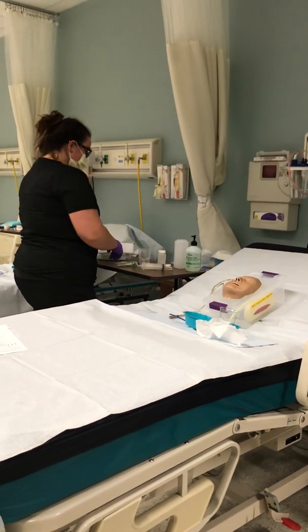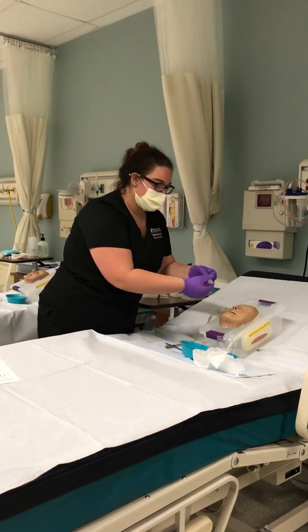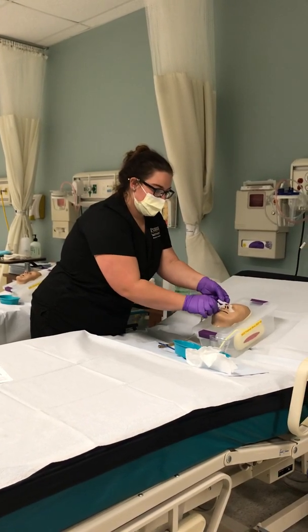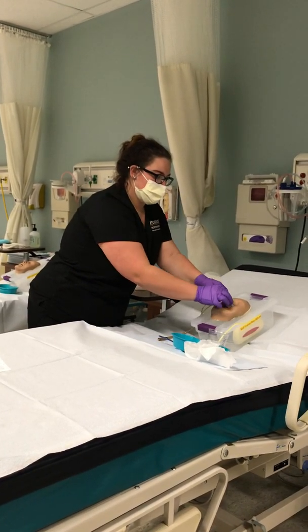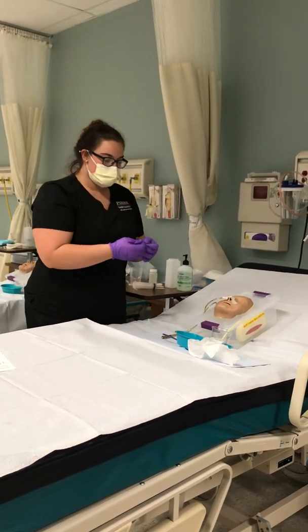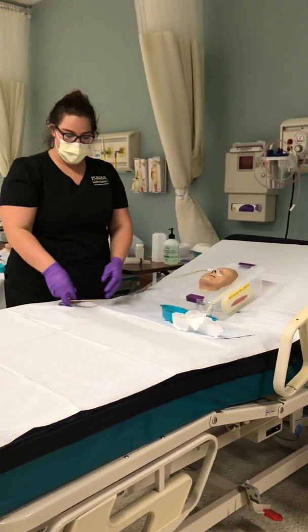Then before you begin to secure it, you would wipe off the nose, make sure it's clean, let it dry, and then you would go ahead and make sure you're not covering the other nostril. Wrap this around and make sure that it is secure there above the nose. It wouldn't normally be as big as that. Then you would secure it on, then you would want to measure the length. You'd measure the length of the tube from the nostril all the way to the end.